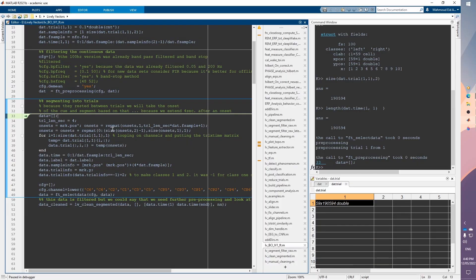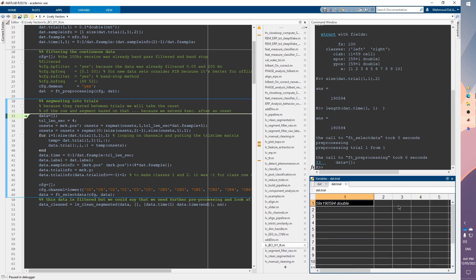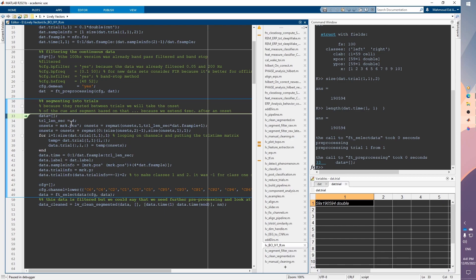In this part we need to segment our data. We already have the continuous recording inside that trial with sensors by samples, but to do something interesting with the data we need to know the exact place of our cues or markers — the beginning of every trial — so we can separate trials of left hand motor imagery from right hand motor imagery and start doing different analyses on that. We get four seconds of motor imagery per trial.